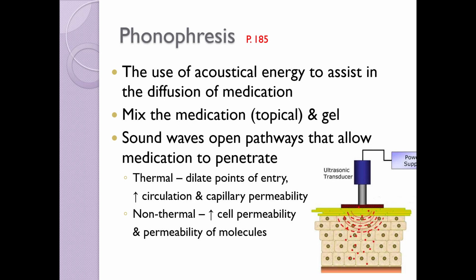The effects of phonophoresis in utilizing thermal ultrasound include dilated points of entry, increased circulation, and capillary permeability. The effects of phonophoresis in utilizing non-thermal ultrasound include increased cell permeability and the permeability of molecules.